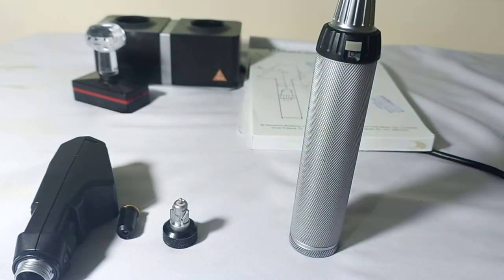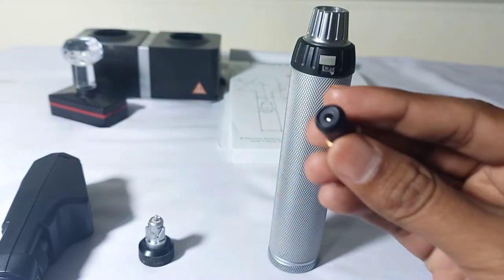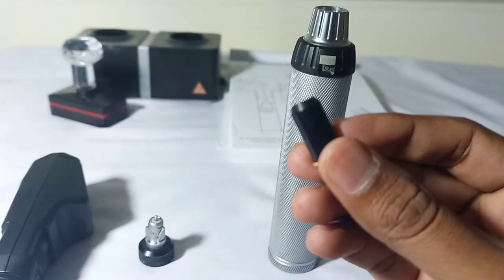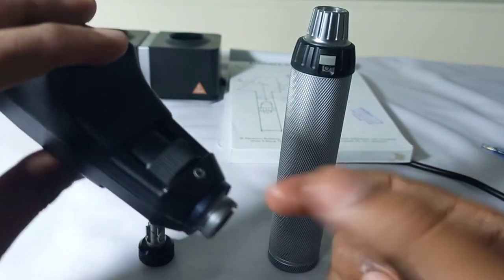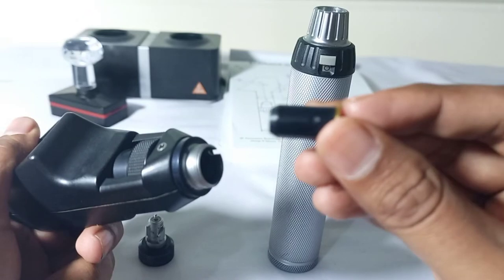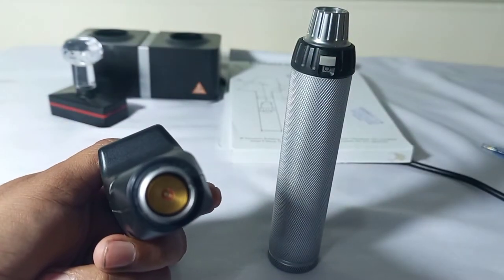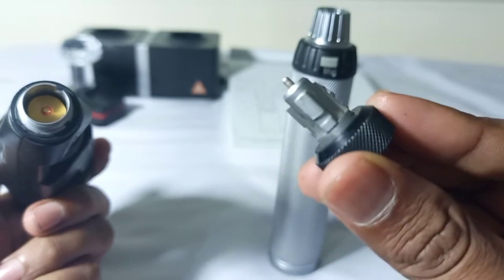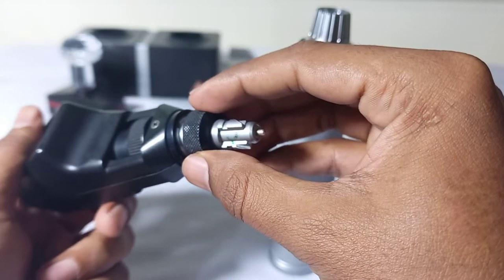Now we will move toward the neck of the retinoscope. This is called the light source — the bulb of the retinoscope. This light source, this bulb, will fix inside the neck of the retinoscope. I will put this bulb inside the neck of the retinoscope, and this device is used to fixate the light source inside the neck of the retinoscope.